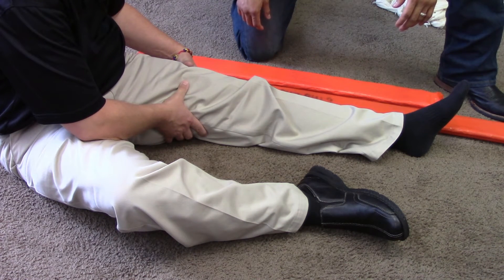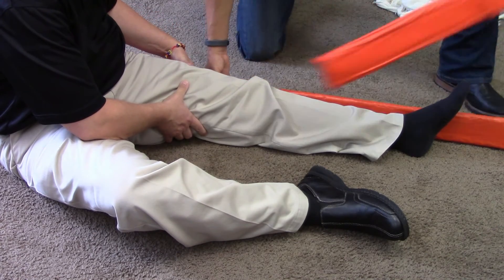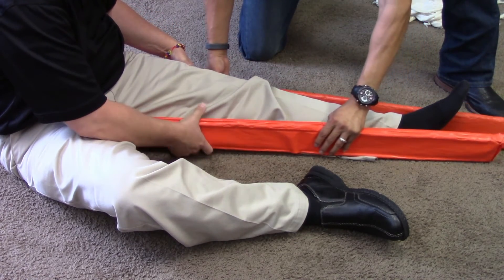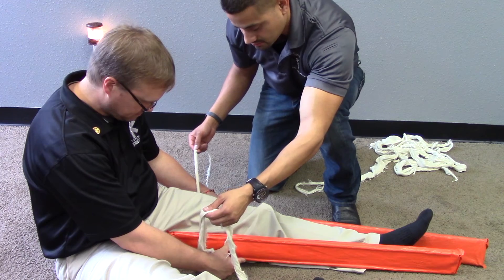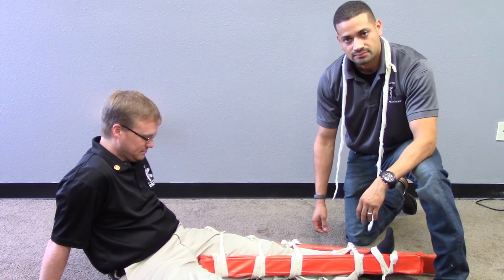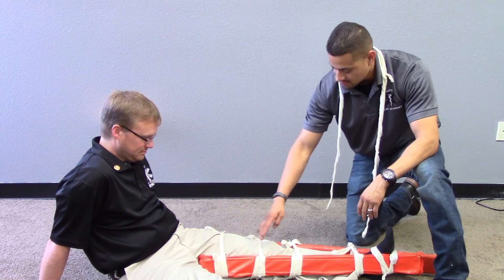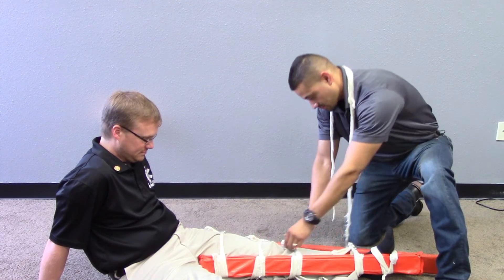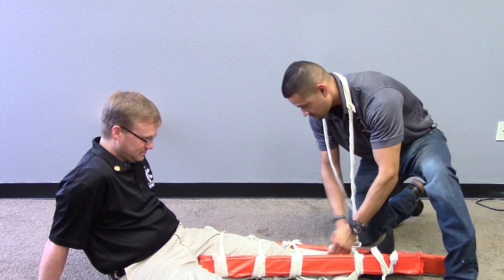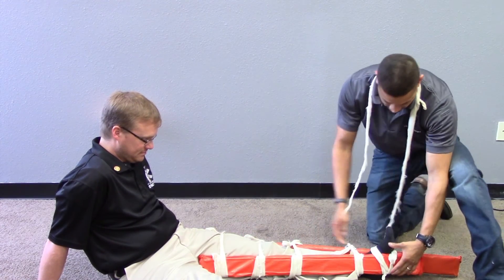Measures the splint. Applies the splint. Immobilizes the joint above the injury site. Immobilizes the joint below the injury site. Secures the entire injured extremity. And lastly, immobilizes the foot in the position of function.